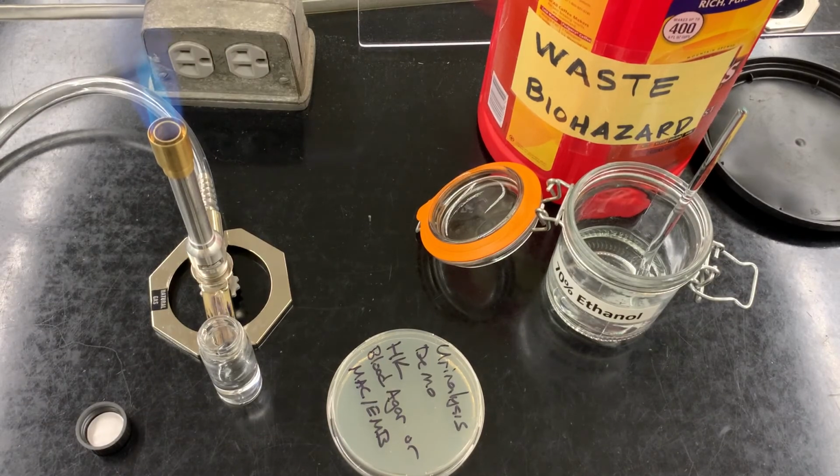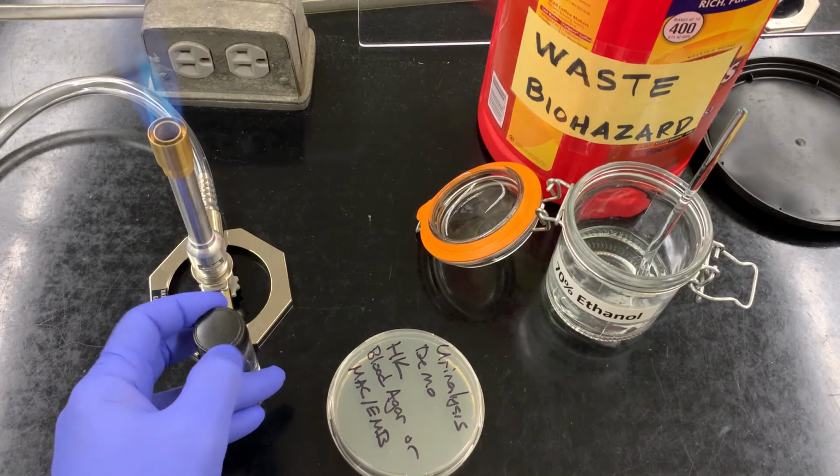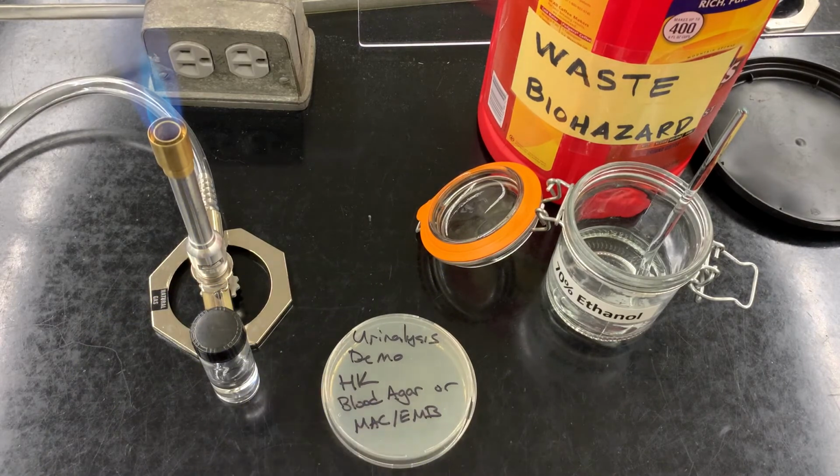And that's it. That's our throat swab, our quantitative urinalysis. Through this analysis, we can then try to figure out, A, how much bacteria is present in the urine, right? And there's a scale that's in your book that'll let you know whether you have no significant growth, whether you have infection or an acute infection. And then hopefully we can also get a qualitative analysis as to the general types of microbe present.